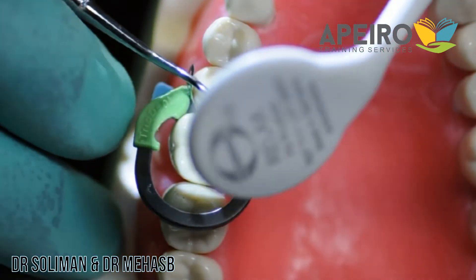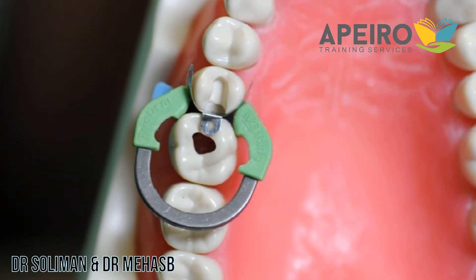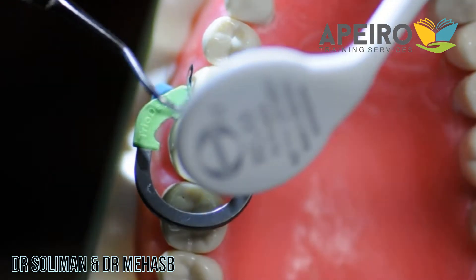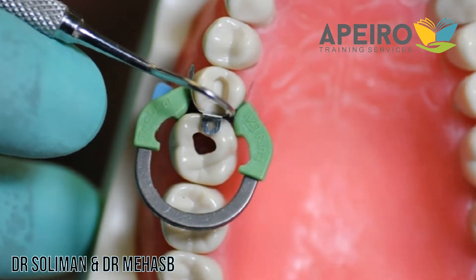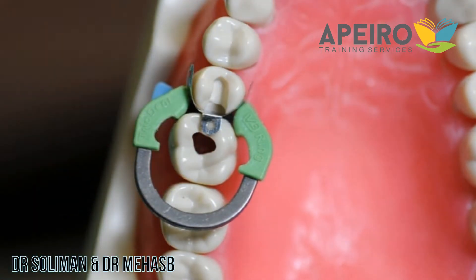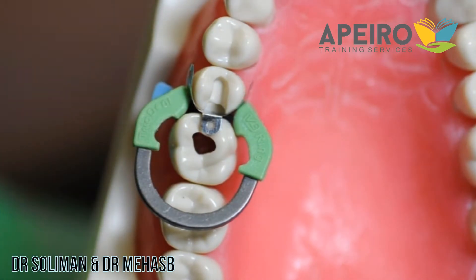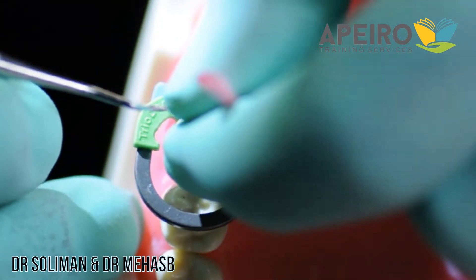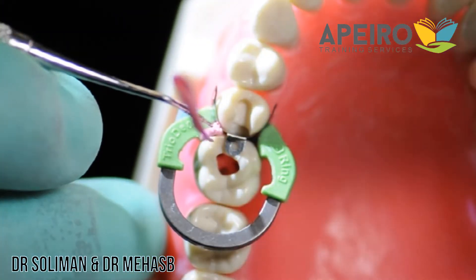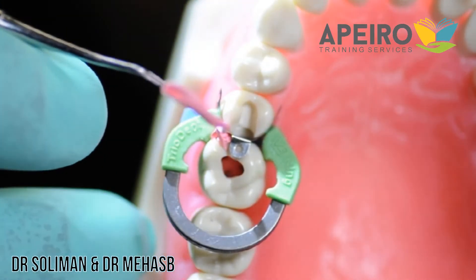Check with a probe for the possibility of leakage at the gingival area, because we are using flowable composite on the gingival seat and we don't want any leakage at this part. You'll also find there are tiny gaps that might get excess material, so what I usually use is Teflon tape — small pieces packed inside. When using Teflon tape, try putting some water on the instrument you are using, which will prevent it from sticking.